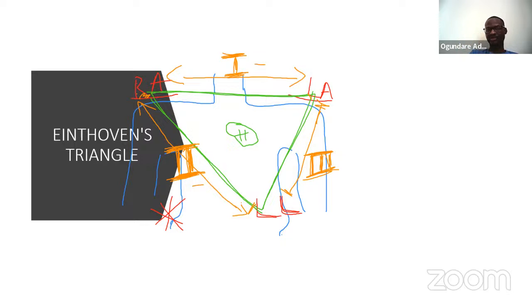that tells you that your right arm electrode is the one that needs adjustment. Then you can look at it on the screen and say, why is this lead 2 and 1 having a wandering baseline, or just not stable on the screen?